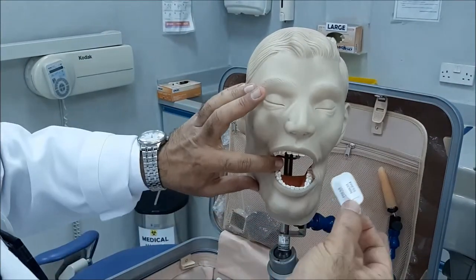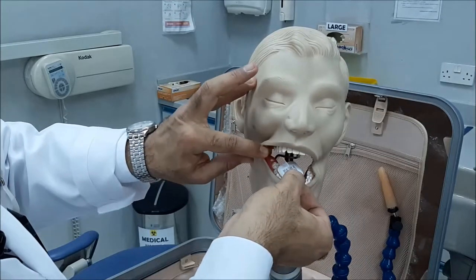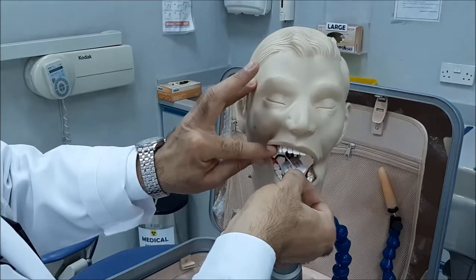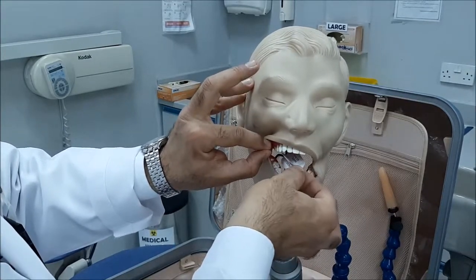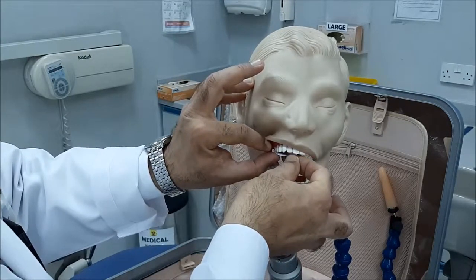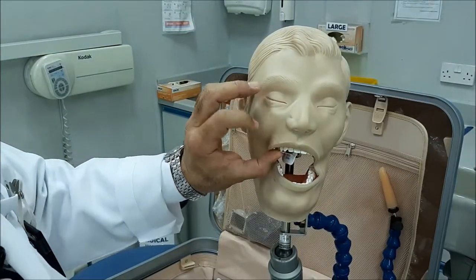You examine your area, then you introduce the film obliquely inside the oral cavity and extend it backwards, avoiding touching anything. Once you reach the two premolars, you flip, and then you place the bite-wing tab exactly under the premolars.